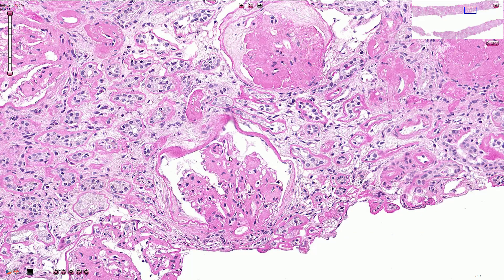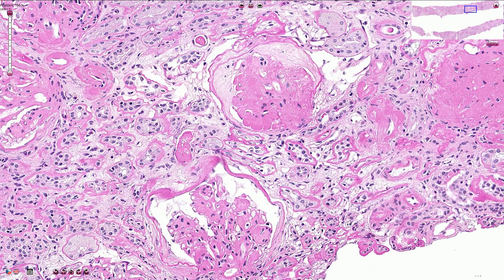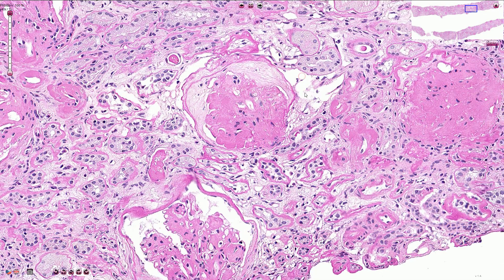The normal function of the glomerular basement membrane is damaged and proteins can pass from the blood into the urine rather than being retained in the blood, so we see high levels of protein in the urine. Similar damage of the glomeruli can be caused by high blood pressure, and end-stage changes like sclerosis of the glomeruli can be caused by both diabetes mellitus or hypertension.